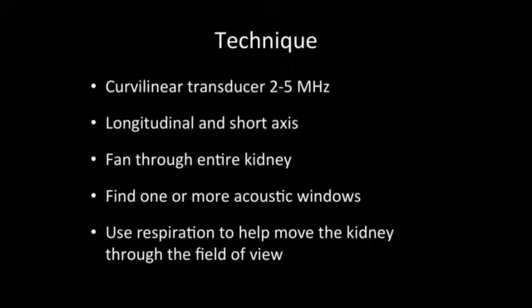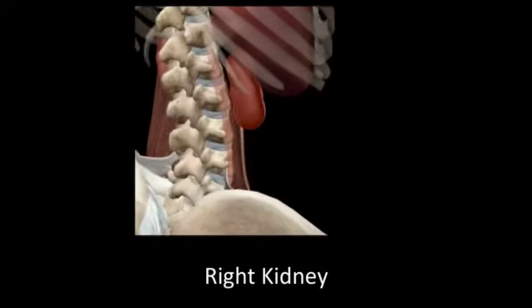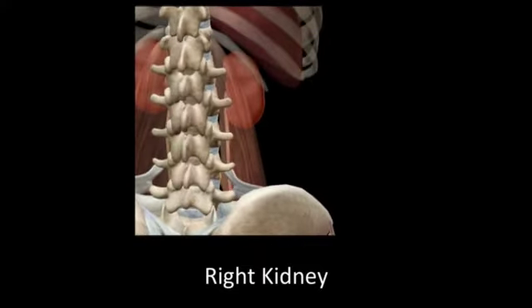So when we think about the right kidney, you can look anywhere from the front to the side to the back, and you can see you've just got to avoid the ribs and you've got to avoid lung and bowel. And so you could put the probe posteriorly here, looking through psoas. You can put it at an angle here between the ribs, or here and go through the kidney, getting a nice view through liver down to kidney. Or you can go anteriorly, but then bowel gas often gets in the way. But if the patient takes a deep breath, sometimes you can look and get a beautiful view that way.